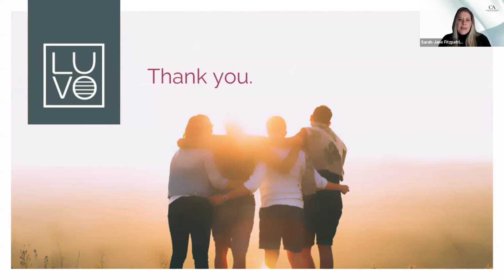How close to the eye can you go? Right up under the eyelash. I come right up to here. Of course, when I get here, I tell them this will be very bright when I'm up at this level. But I try to get, if you miss this on me, I'm 56 years old. I want this treated. So you got to get right in there to treat that.